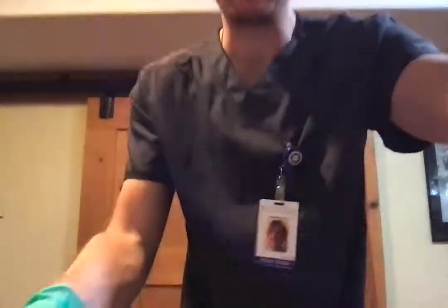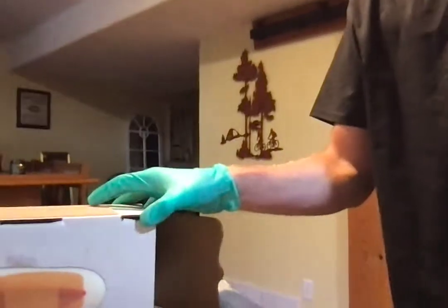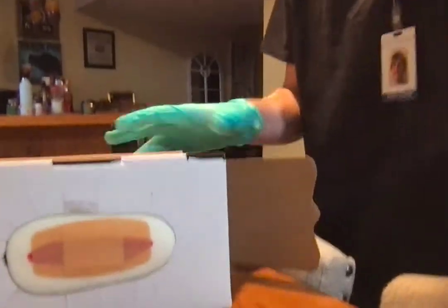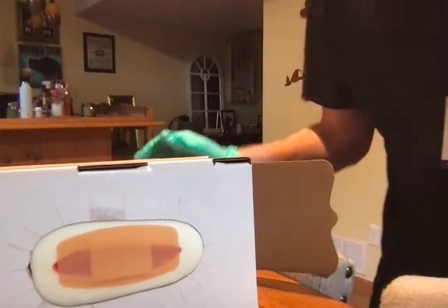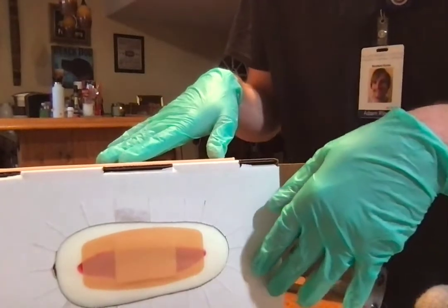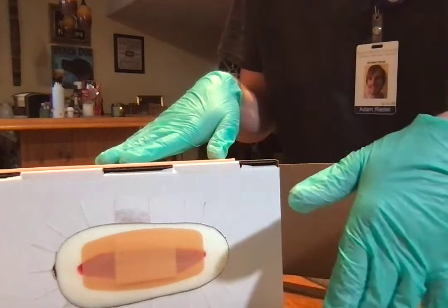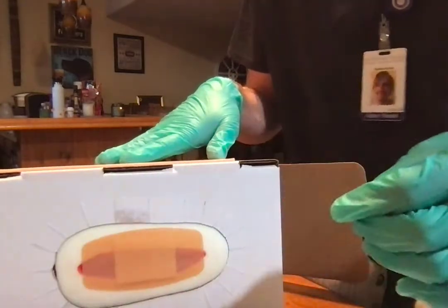And then I'm going to move this a little bit so you can see. And then I'm going to want to use the wound, and I'm going to go parallel to that when I'm taking it off of the patient's skin, and I'd be going across or with the direction of hair growth.